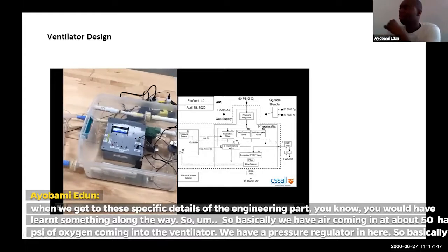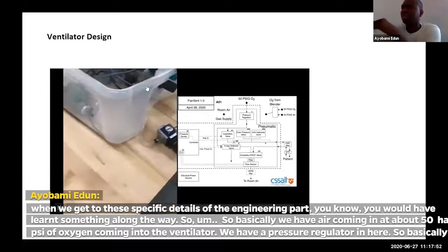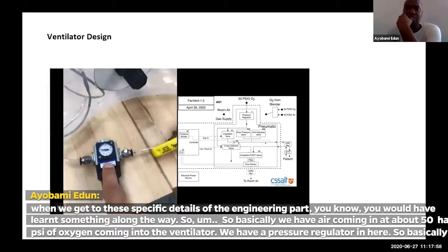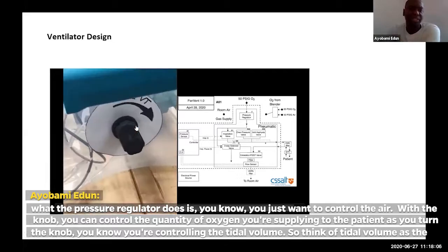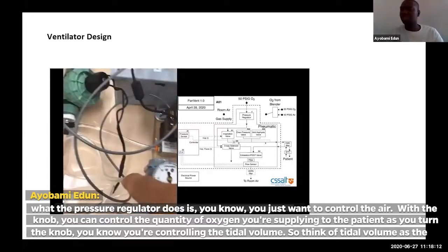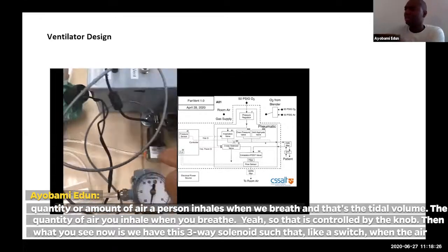So basically we have air coming in, about 50 psi of oxygen coming into the ventilator. You have a pressure regulator in here. What the pressure regulator does is, with the knob, you can control the quantity of oxygen you are supplying to the patient. As you turn the knob, you are controlling the tidal volume. Think of tidal volume as the amount of air that the person inhales when you breathe. That is controlled by the knob.